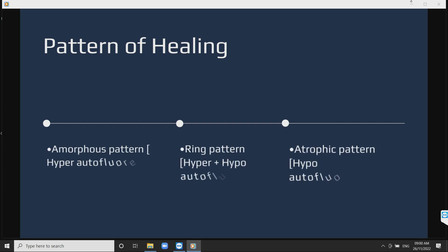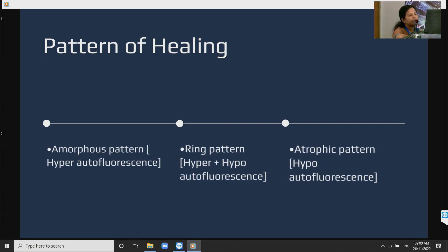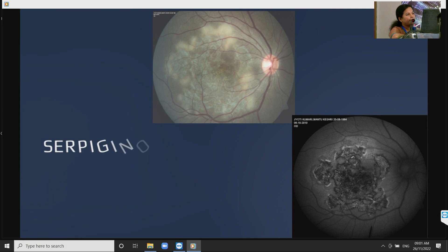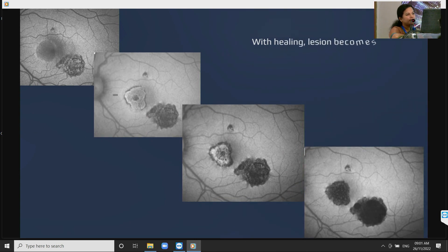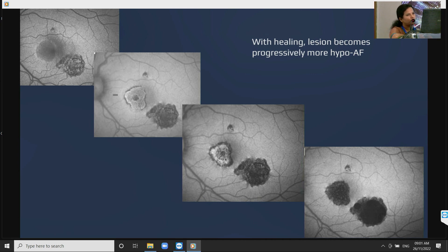The pattern of healing is described as: amorphous hyper-autofluorescence, then a ring pattern of hyper and hypo-autofluorescence, and finally an atrophic pattern of hypo-autofluorescence. Similarly in serpiginous choroiditis, it helps in detecting early reactivation of an old lesion — it appears as a ring pattern of hyper-autofluorescence at the edges of the old lesion, and as it heals it becomes totally hypo-autofluorescent.